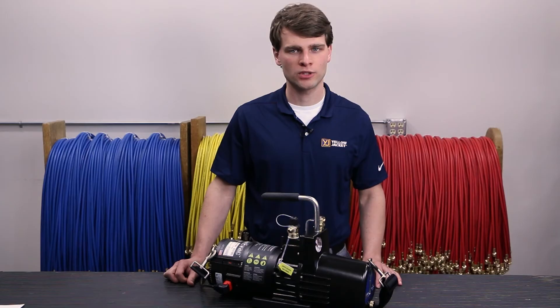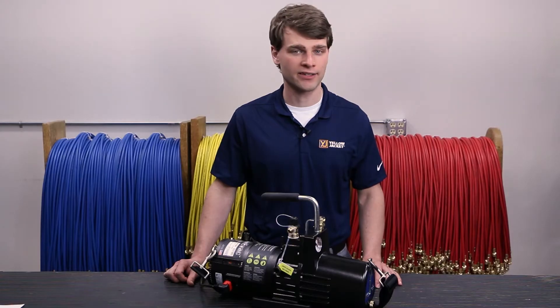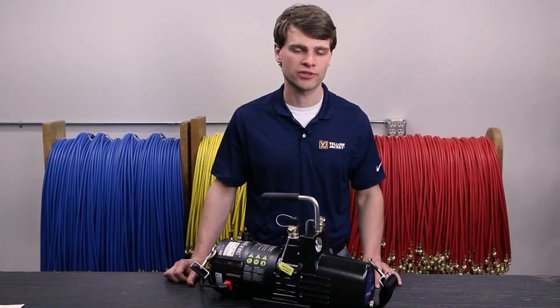Never run the SuperEvac Plus II on a voltage source higher than the voltage input setting. If the voltage selector switch is set at 115 but a 230 volt input is supplied, it could damage the control electronics and void the manufacturer's warranty.